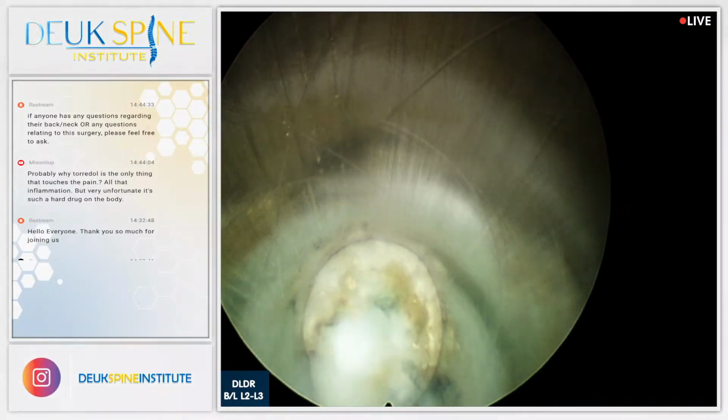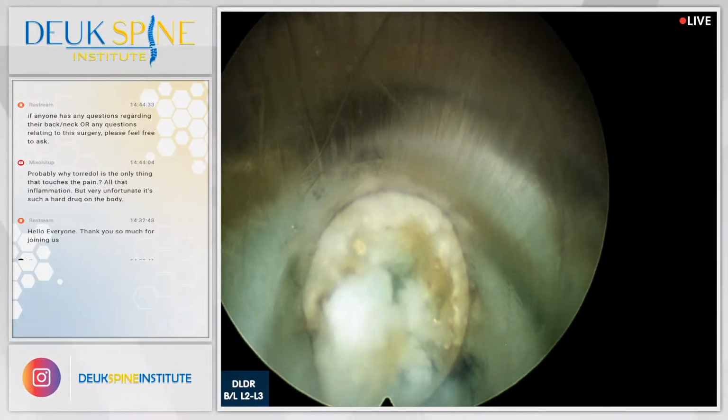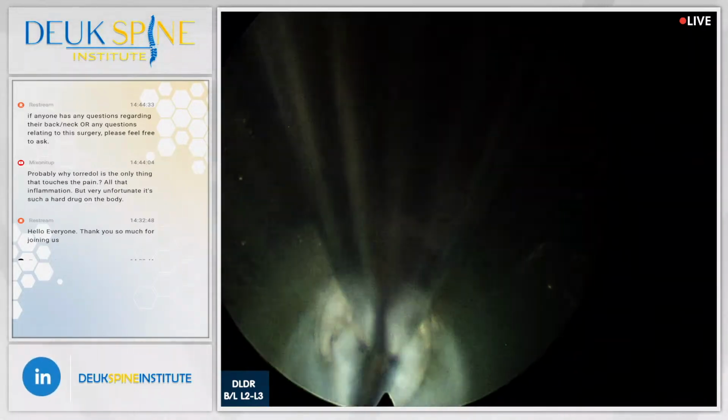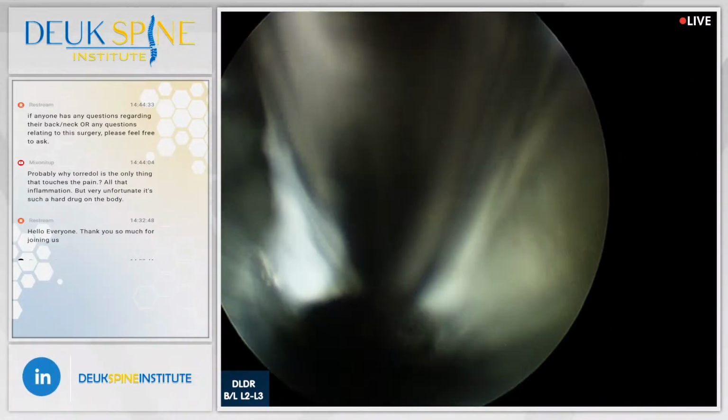There's another piece. Everything okay, guys? Good. How's he doing, doctor? Good. All right, that's what I like to hear.